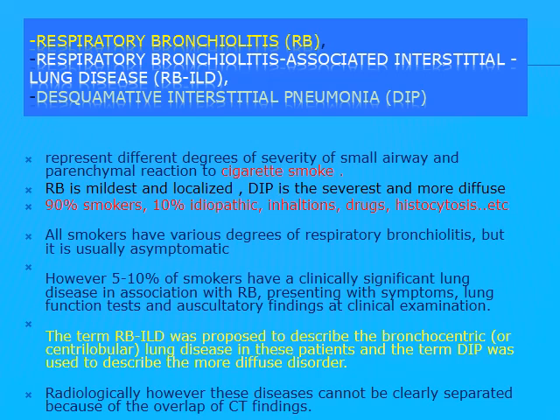The term respiratory bronchiolitis interstitial lung disease was proposed to describe centrilobular lung disease in patients, and the term diffuse or desquamative interstitial pneumonitis was used to describe a more diffuse disorder. As I have told you, it is a spectrum from the mildest to the severest in smokers.